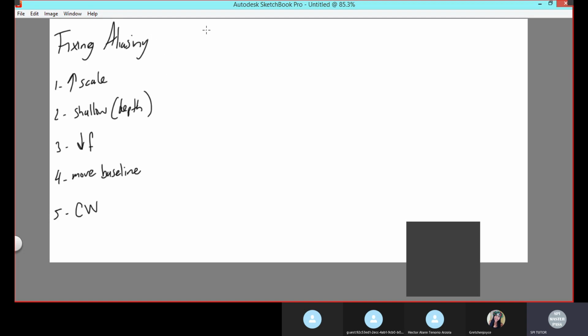So fixing aliasing. When you have aliasing, your waveform, your velocity, your blood is moving faster than your Nyquist limit. Your Nyquist limit is your limit. That is how much you can handle and still measure things accurately. Okay, so have that in your mind that you have a limit. The machine has a limit, and anything on that limit or less, you can measure it. You can have an accurate waveform. But if you go over that limit, that's when it becomes aliasing. So at the limit or less, you can measure it, you can be accurate. That is that maximum limit that you can handle.